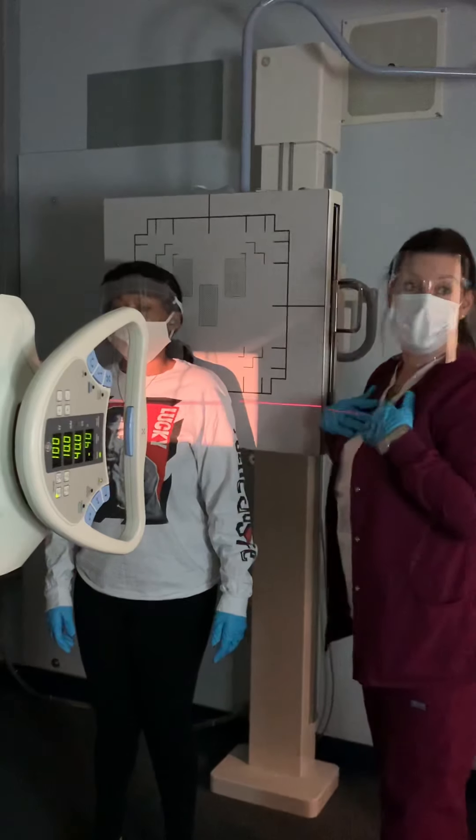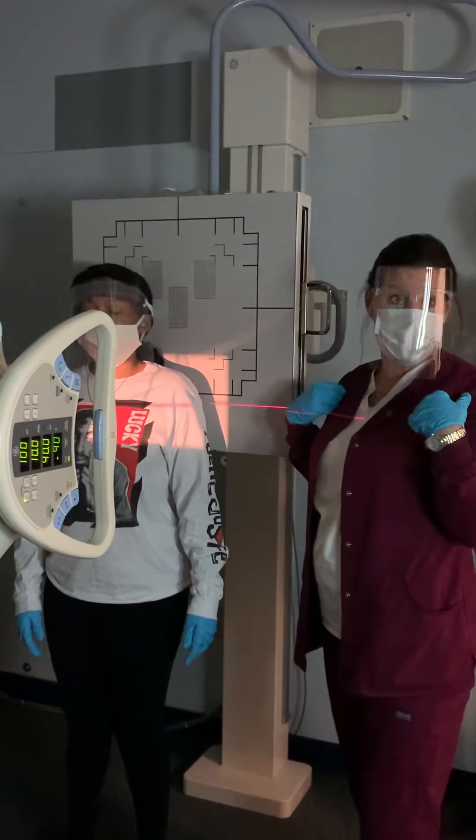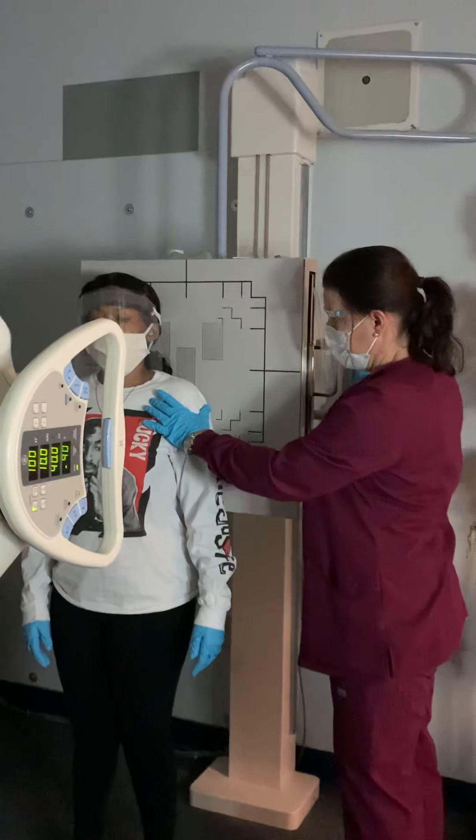Her necklace would have to come off — everything from the waist up, bra and shirt would come off, and we put a gown on her. I've got the center to the coracoid, and I'm bringing this board down behind you.